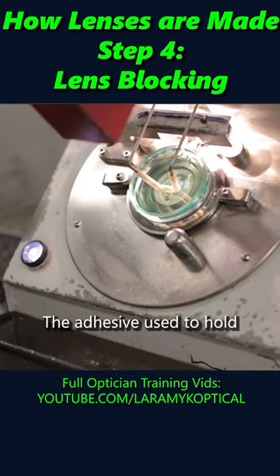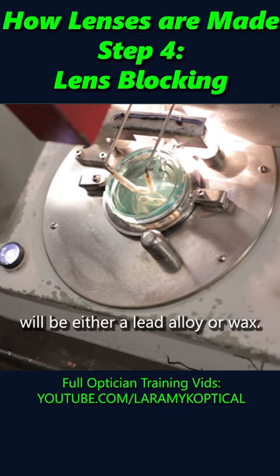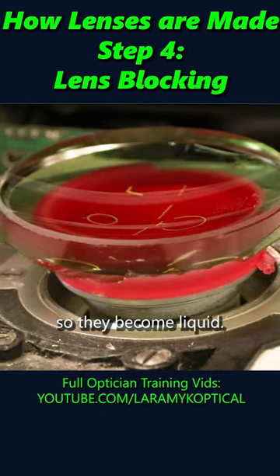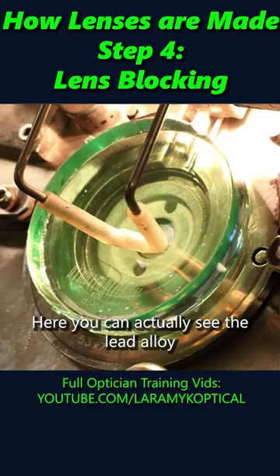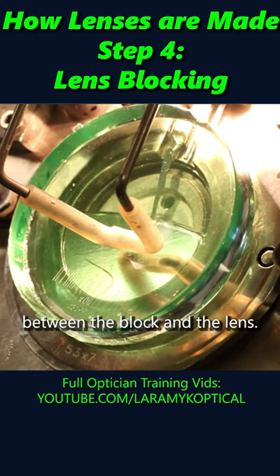The adhesive used to hold the block to the lens will be either a lead alloy or wax. Both are heated to their melting point so they become liquid. Here you can actually see the lead alloy filling the void between the block and the lens.